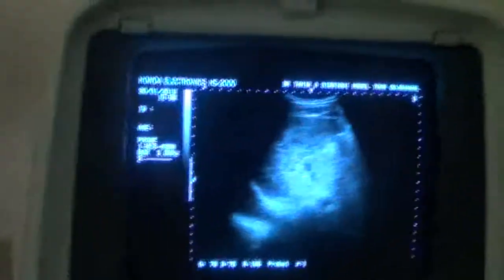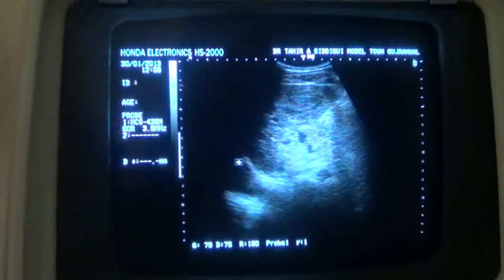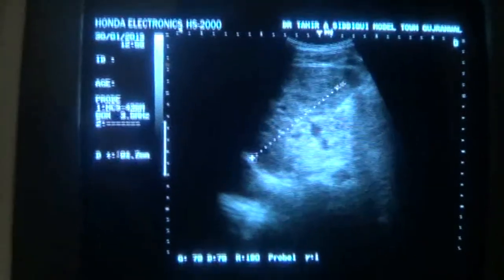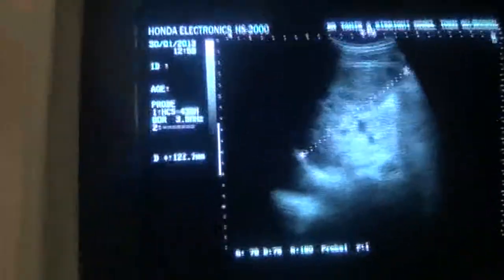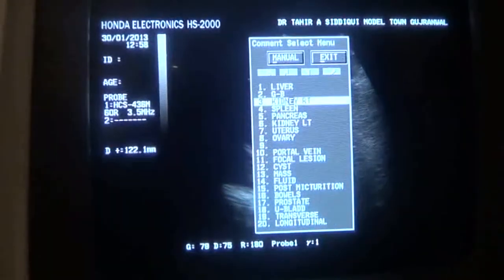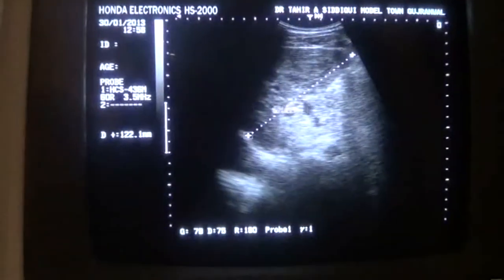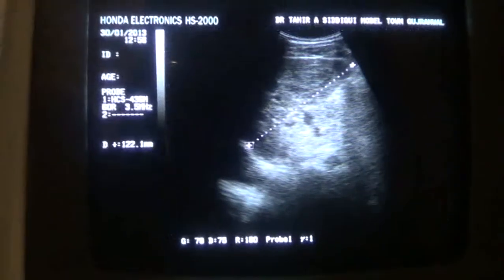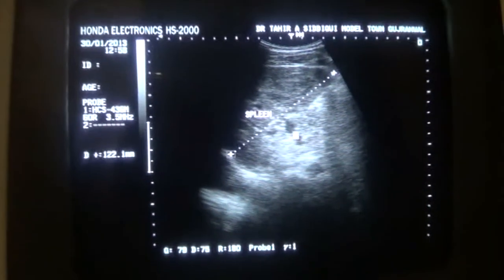This is the spleen and this is the left hemidiaphragm, part of it. The spleen measures approximately 12.2 cm. This is borderline because up to 12 cm is considered normal. So this is the spleen from pole to pole measuring 12.2 cm.